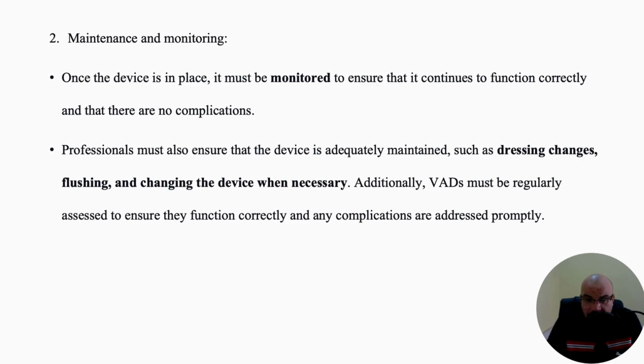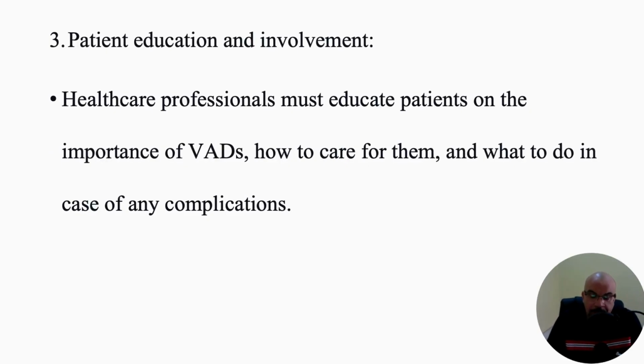Maintenance and monitoring, of course, is also challenging, and the challenge comes from how the maintenance and monitoring will be done and the compliance of the people in carrying out this maintenance, regarding the dressing change, and knowing exactly what the signs and symptoms are when seen, so the healthcare provider has to make an intervention to remove or change the dressing or change the way of management or dealing with that.